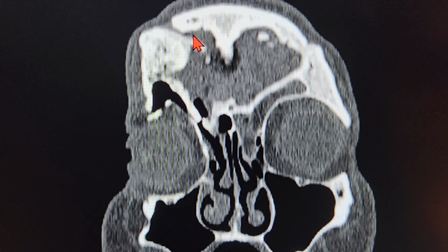There's one open channel here, so probably they must have done a craniotomy, a supraorbital craniotomy, to approach the frontal sinus directly head on, because the neurosurgeons usually, whenever they have to approach the frontal sinus, do a supraorbital craniotomy, or they go as a transbasal approach through the hemicoronal, or you can say the bicoronal incision, basically keeping the pericranial flap intact.